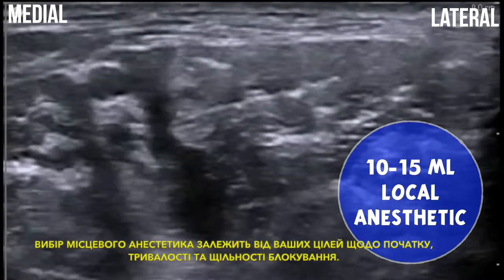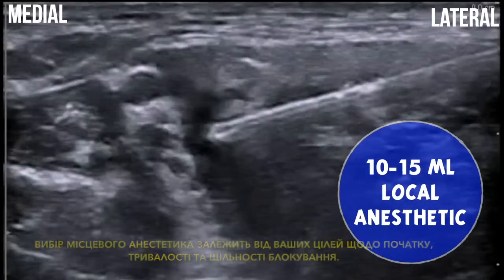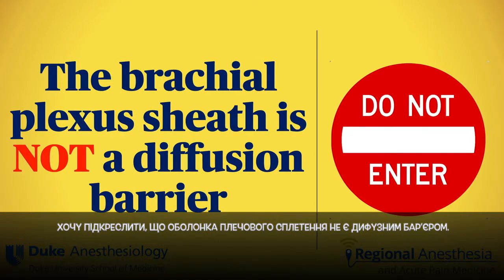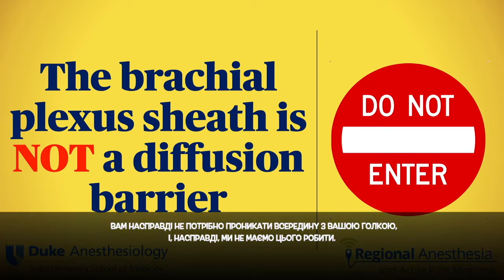The choice of local anesthetic obviously depends on your goals for onset, duration, and block density. Now, I want to emphasize that the brachial plexus sheath is not a diffusion barrier. In other words, local anesthetic placed outside the sheath easily diffuses across and quickly anesthetizes the nerve structures. You don't need to actually get inside with your needle, and in fact, we really shouldn't.